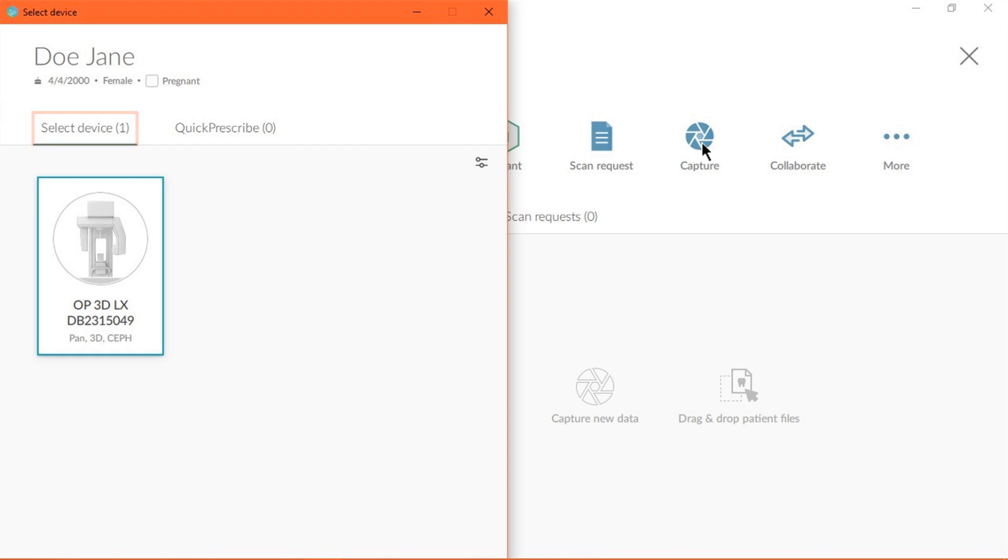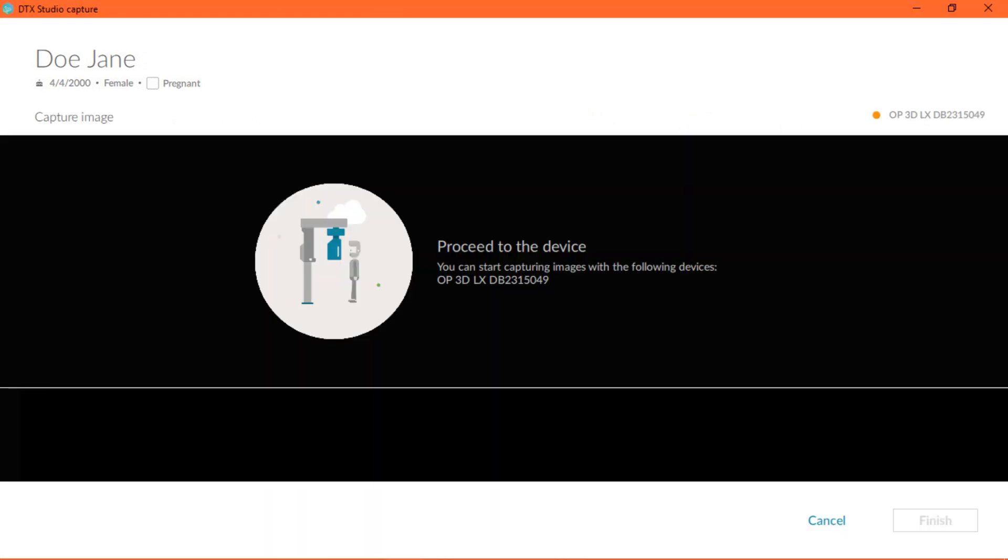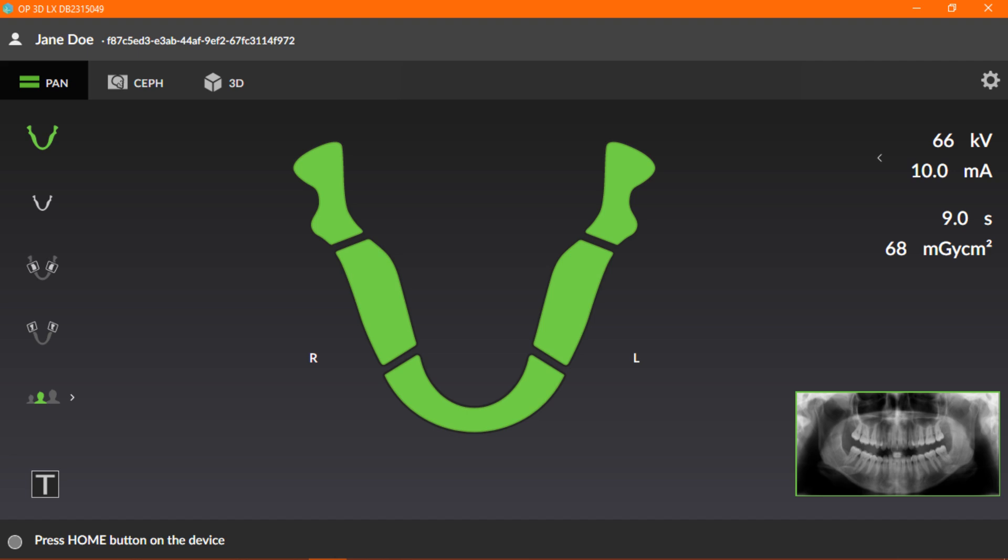Next, under Select Device, click OP3D LX. The Proceed to the Device window displays briefly until the imaging program loads. Once the imaging program is displayed, click the 3D tab.